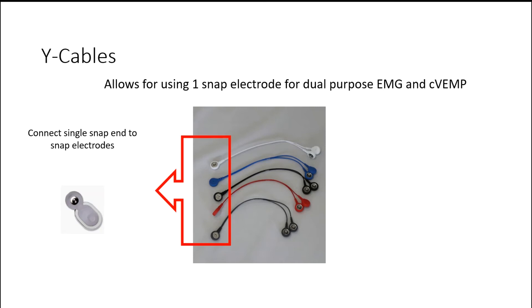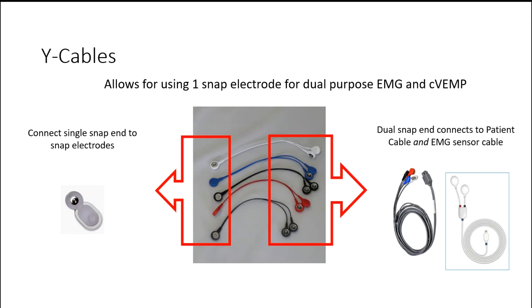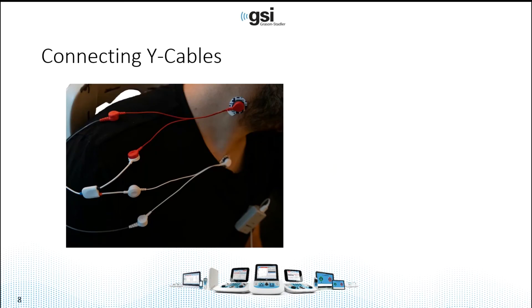To use these cables, locate the single snap end and connect that to the snap electrode — this is what goes on the patient's neck and sternum. The dual side connects to the patient cable and the EMG sensor cable. You can see an example on a patient where the snap electrode is located on the muscle of the patient's right side, and it splits where half connects to the EMG sensor cable and the other to the snap electrode lead cable. The same goes for the white sternum electrode: one electrode on the sternum splits to the EMG sensor cable and the patient cable.